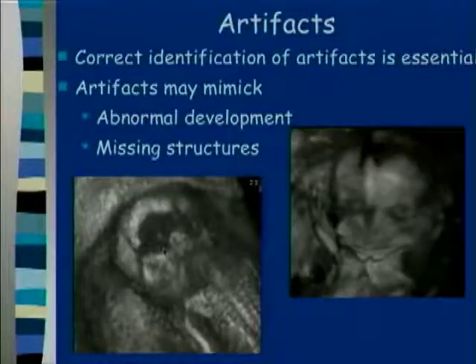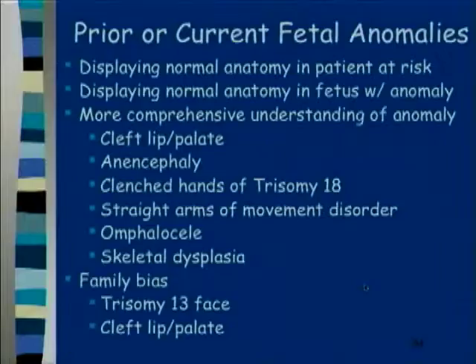And when we first started doing 3D, a lot of patients would say, why is there a hole in the head? But it's just that the rendering box is going through the cranium. And you can see this looks like a conjoined twin or something with two faces, but it's just that the single fetus moved, and that you can get part of both faces when it moved.